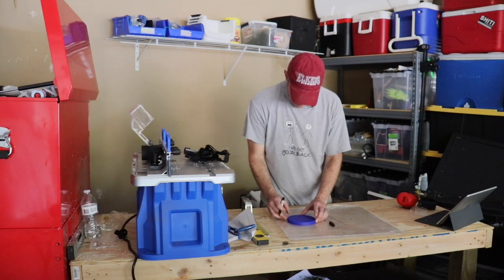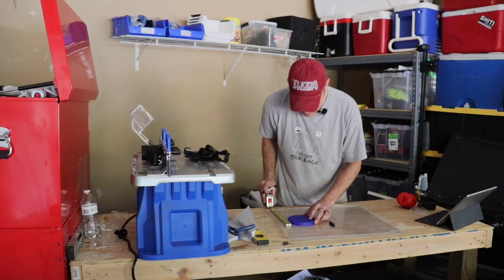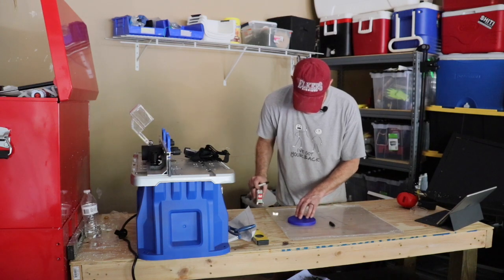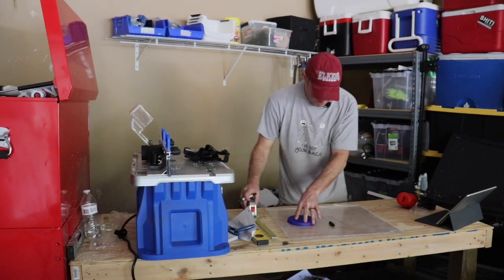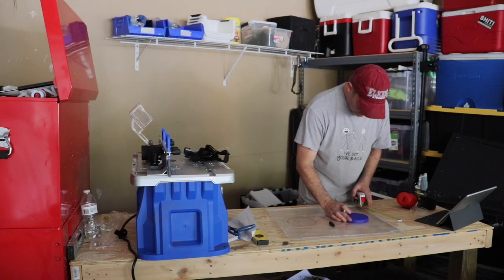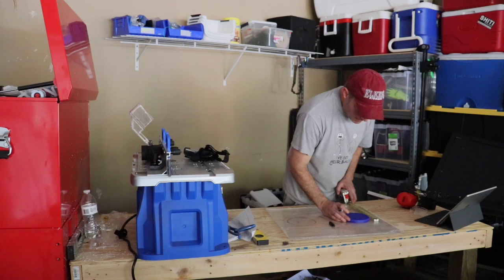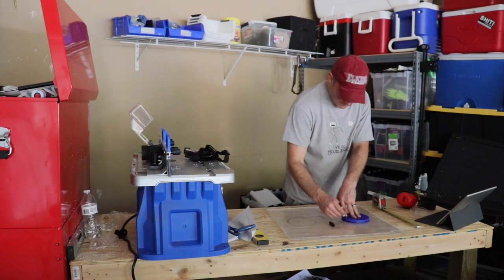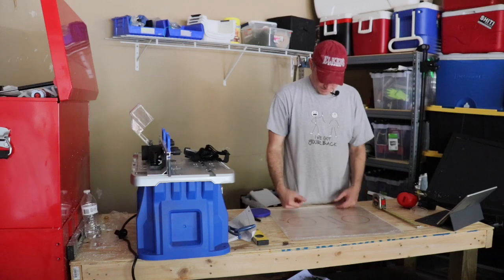And then I'm going to set the edge of my hole right there. I'm just kind of eyeballing where the center is. There's a little mark right in the center of that cap, so I'm trying to line that up 2 1/4 from the side. I'm just going to outline there. And then same thing, going to my 2 1/4 mark. Got this at 2.5. Going to line it up and down. Circle that out. And now there are hand holes to reach in and do our stuff with.